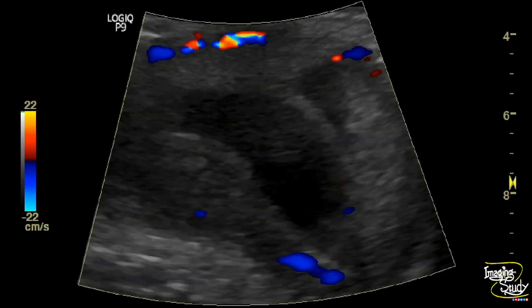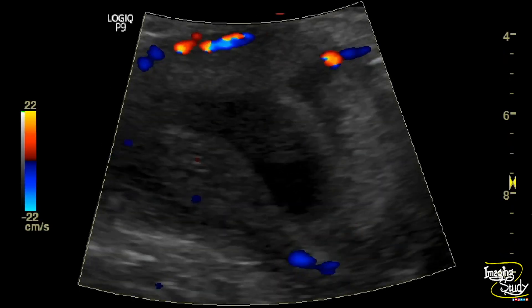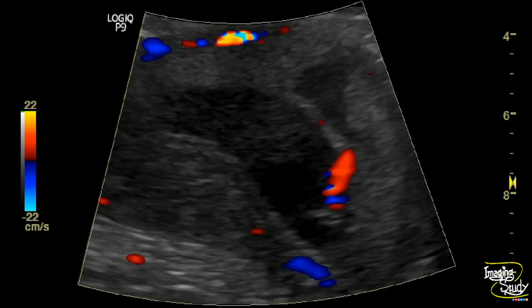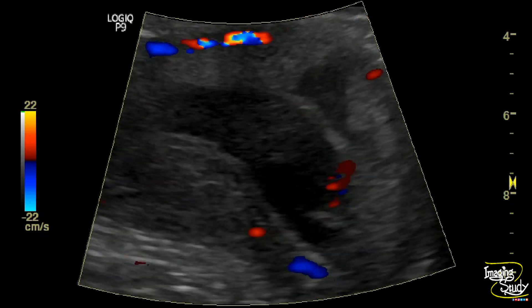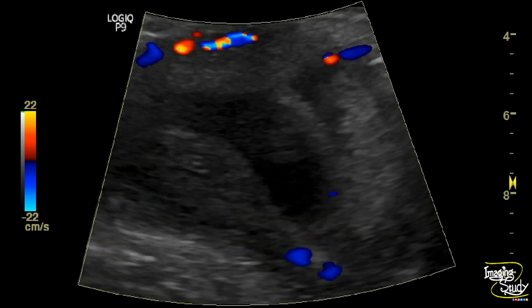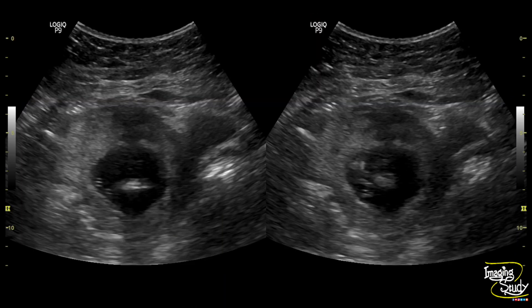Here is the color Doppler on the magnified image. Here is the picture showing the transverse section of the uterus, and you can see this irregular hypo-to-anechoic area at the anterior wall at the subchorionic level.